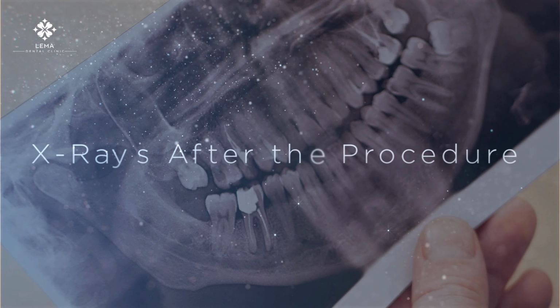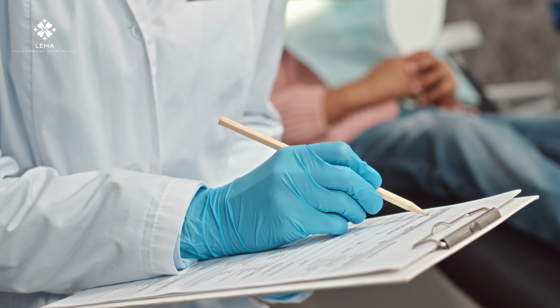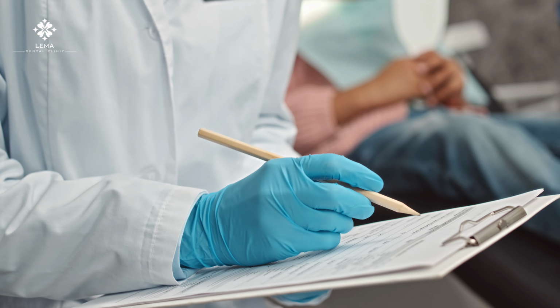X-rays after the procedure. After the root canal treatment, a final X-ray is typically taken to confirm the canals have been successfully sealed and the tooth is properly restored. This X-ray provides an essential record of the completed procedure and helps the dentist ensure that there are no lingering signs of infection. This also allows for future reference if any further dental work is needed.